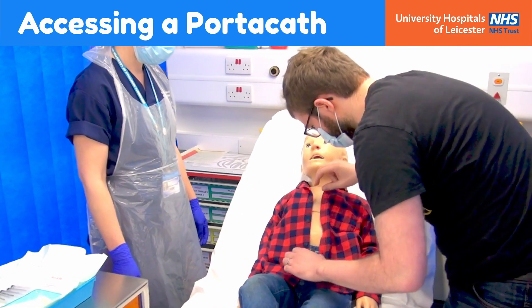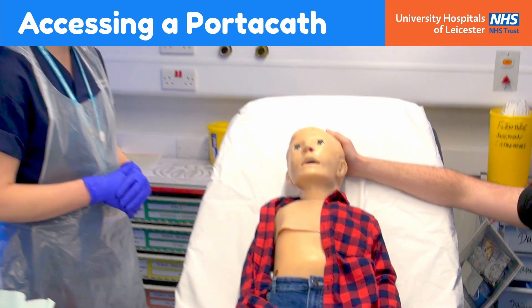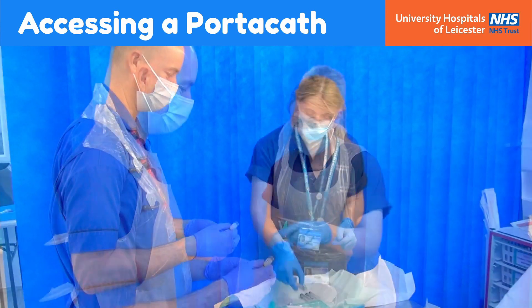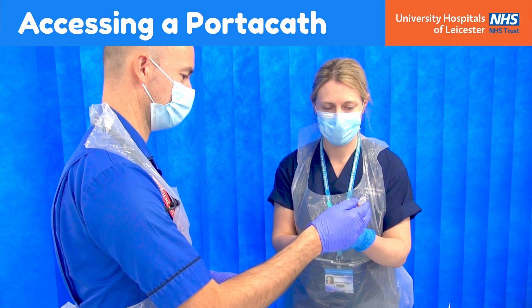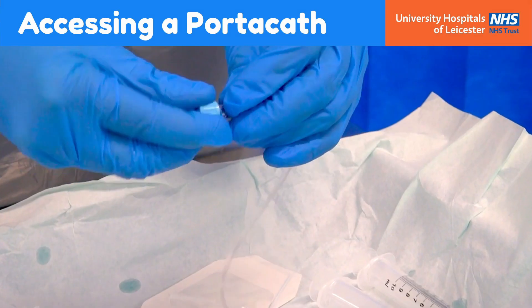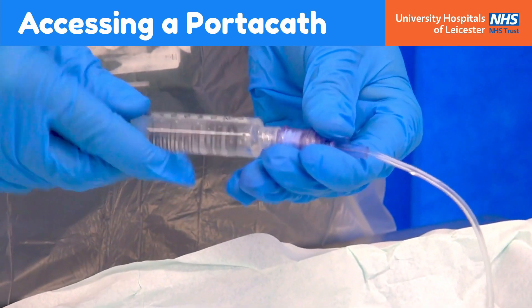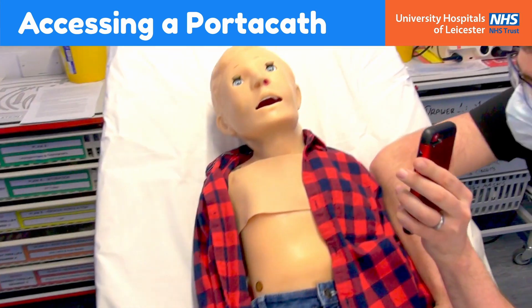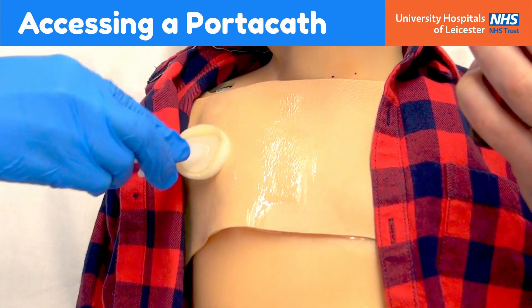Position the patient on the bed in a semi-reclining position and expose the area. Remove amitop if this was applied and ensure that the site appears healthy with no sign of infection, dislodgement or injury. Wash your hands and apply sterile gloves. Draw up the 10ml of 0.9% sodium chloride and 4ml of heparin sodium 100 units/ml in a sterile manner. Connect the bionecta to the gripper port needle tubing, then prime the line fully with the sodium chloride. Clamp and leave the syringe attached. Clean the skin with a checkerboard motion for 30 seconds and allow it to dry for 1 minute.